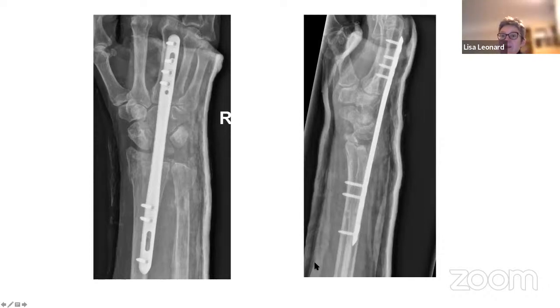Well, I think Sumed pretty much covered it. I mean, the carpus wasn't aligned with the radius and it is unreconstructable. I don't think you're going to get any screws in any of that. So this is the best option, I think, for, you know, it's out to length. You haven't had to do anything to the ulna. And actually, we usually take these out after about 3 months just to see if they can get a jot of movement afterwards. But at least if you need to do something like a fusion or a wrist replacement, possibly you would have something that was lined up vaguely. So I think she did quite well.